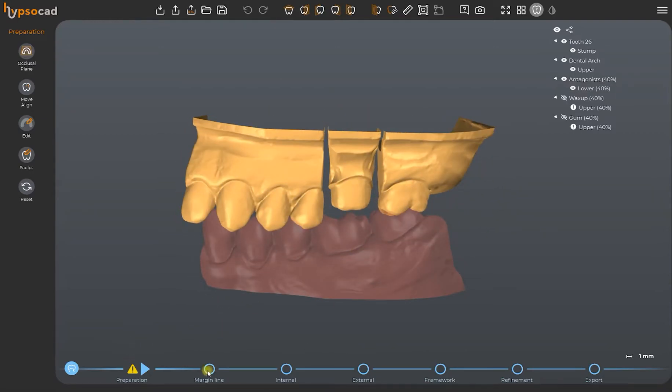At the bottom of the screen, you find the step bar, which will guide us through every step to the final export of the project.